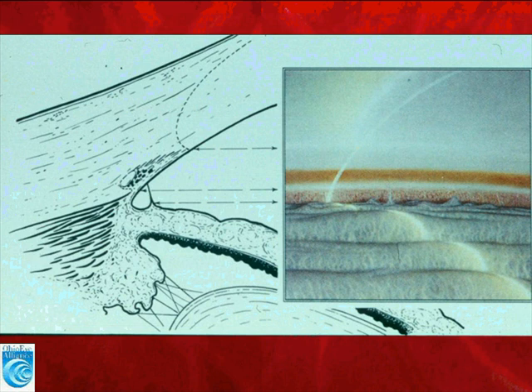Notice about the pigmentation in trabecular meshwork that it's very, very smooth, and this is because this represents very fine granules of pigment, which are often seen in conditions like pigment dispersion syndrome. Notice that the pigment in the drawing on the left is very deep within the trabecular meshwork and juxtacanalicular tissues. Again, this is because these are very, very fine granules of pigment.